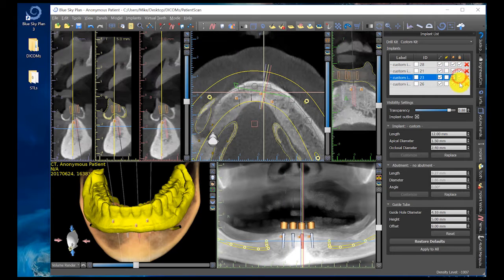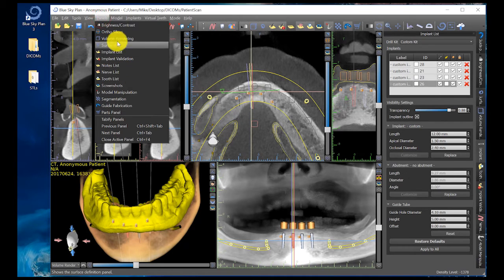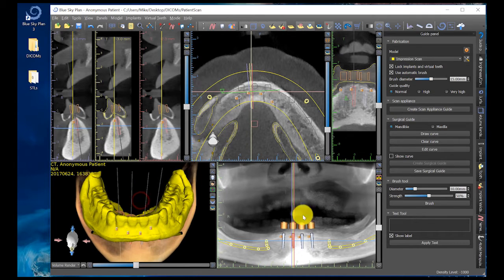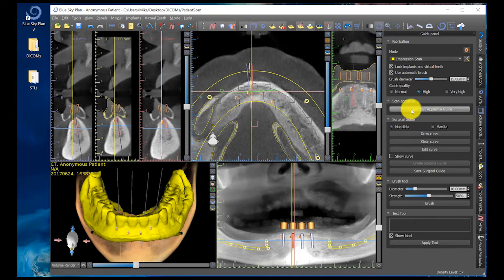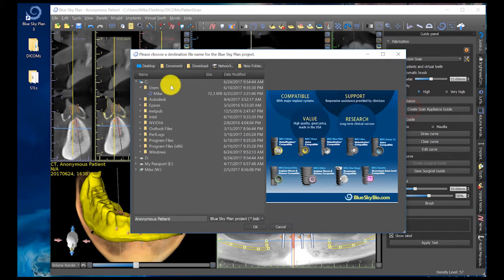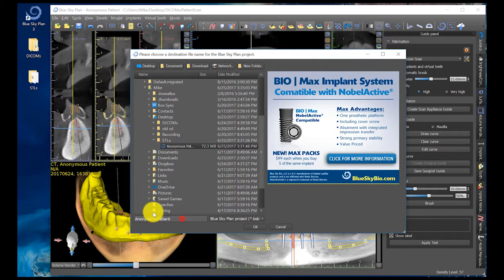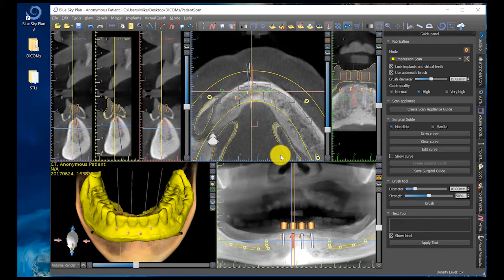I click on Panels, Guide Fabrication. In the guide fabrication panel, you don't need to do too much — the simplicity of this surgical guide technique is amazing. Click on High for the guide quality, make sure Impression Scan is selected, left click and choose Impression Scan, make sure it says 'lock implants and virtual teeth,' and make sure Mandible is selected. When I click 'Create Scan Appliance Guide,' it pops up to the desktop asking me to save the file. I'll save it as anonymous patient. Click OK and it processes the surgical guide.